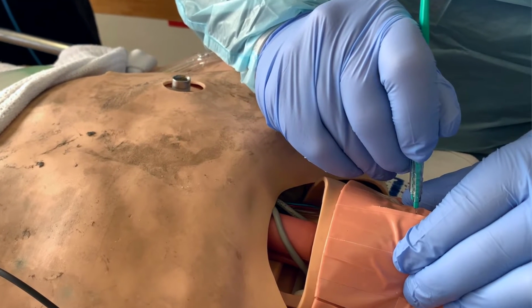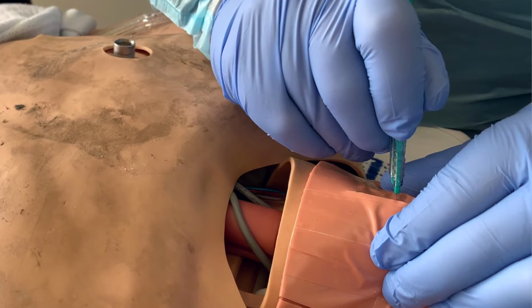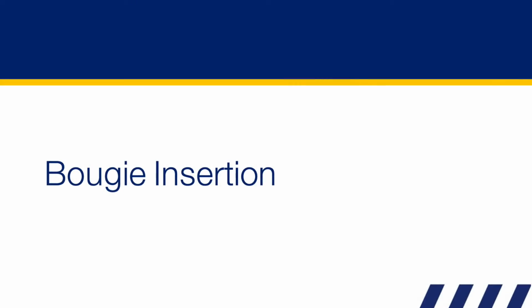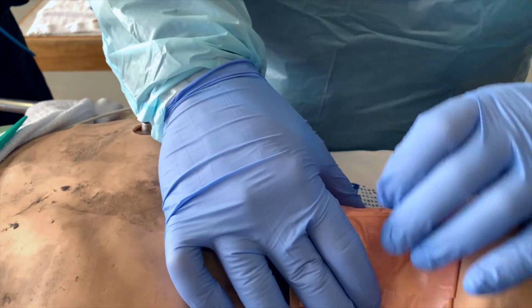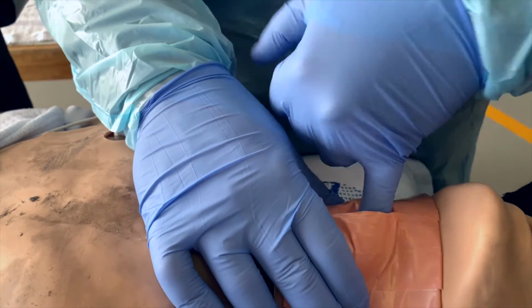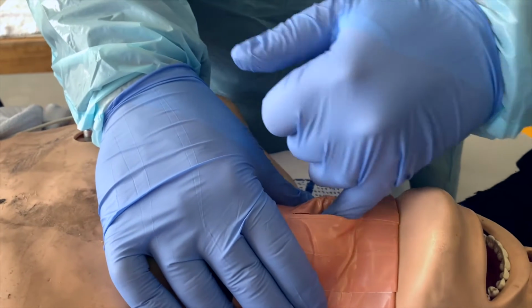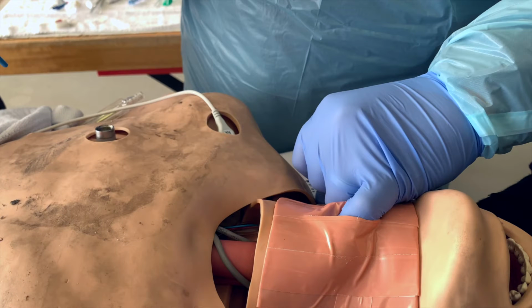Be careful of atomized blood spray when cutting into the cricothyroid membrane, particularly in the spontaneously breathing patient. With the non-dominant hand, insert your gloved little finger into the incised membrane to dilate the opening. Rotating your finger might help. Ideally, the posterior cartilage wall should be palpated, but this is dependent on the patient's anatomy. Maintain insertion of the little finger. Never leave the newly formed hole unattended, so keep the finger in place until the bougie replaces it.